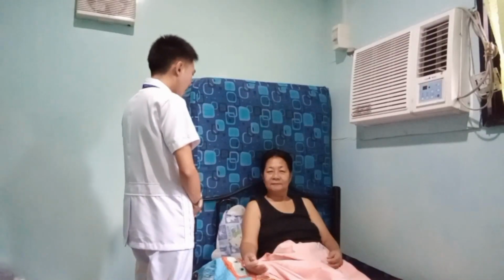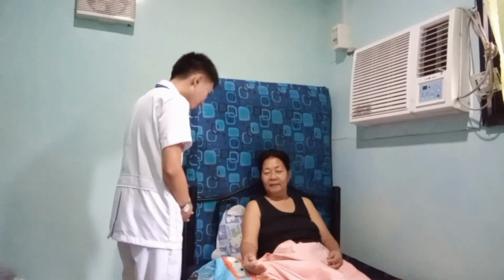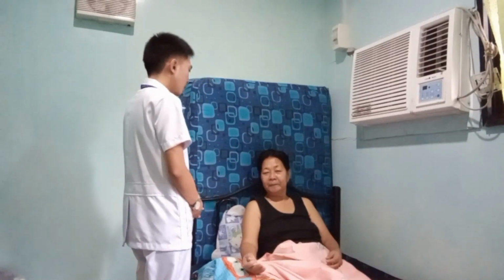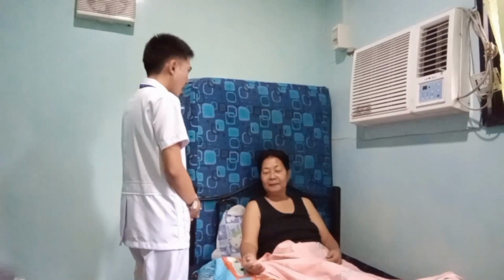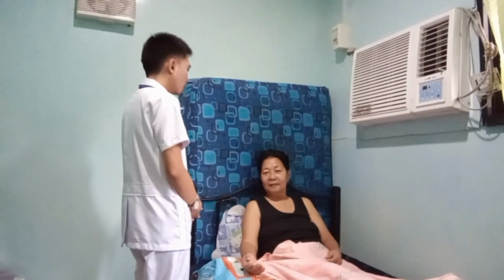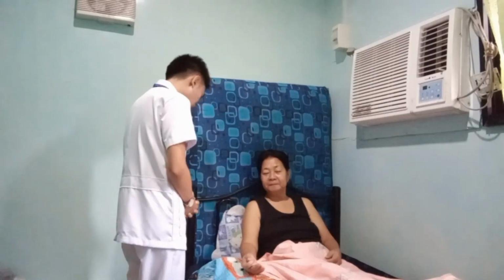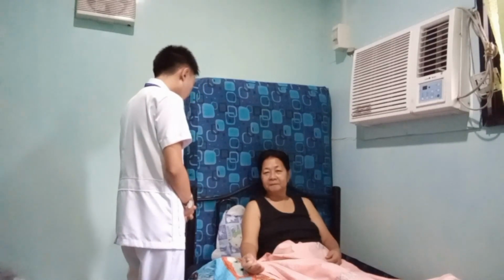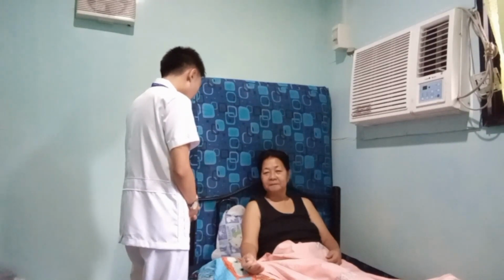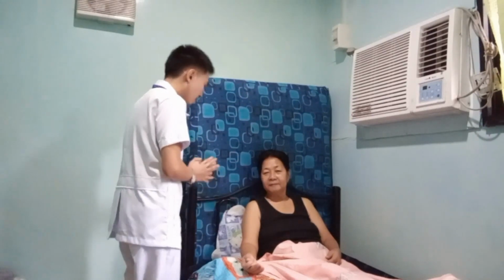Hello, ma'am. Good morning. I am Guadalquiver and I am a student nurse for today. So, ma'am, what is your name? Edna Huerte. When is your birthday? October 25, 1957. And what name should you want me to call you? Edna. Okay, ma'am, thank you. So the procedure that I will be doing is to take your vital signs. So I'm going to touch some parts of your body, and of course, there are other procedures or movements that you should follow. Is that okay with you, ma'am? Okay.